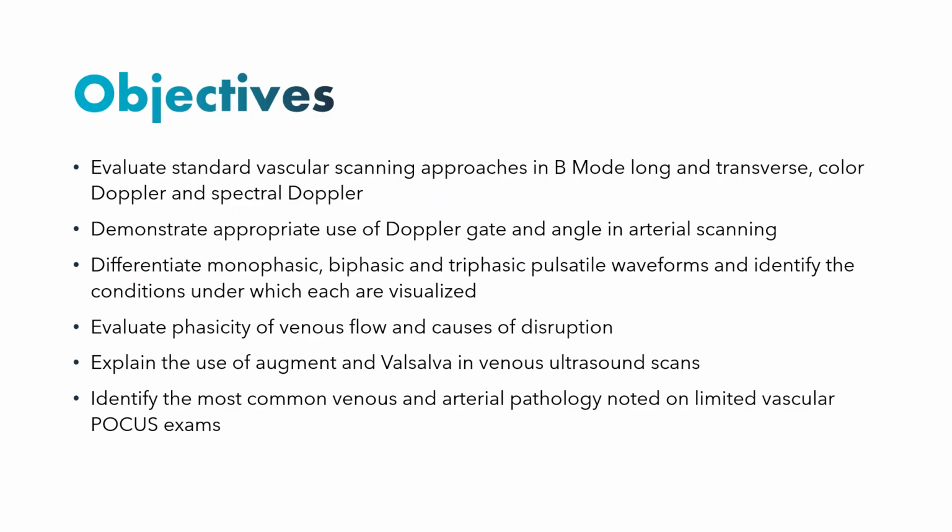So our objectives for today are to evaluate standard vascular approaches utilizing B mode in long and transverse orientation, using color Doppler and spectral Doppler. We're also going to talk about how to demonstrate appropriate use of Doppler gate and angle in arterial scanning to obtain the most accurate velocities possible.